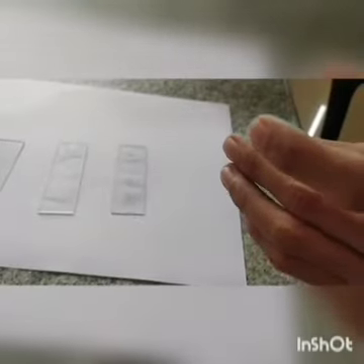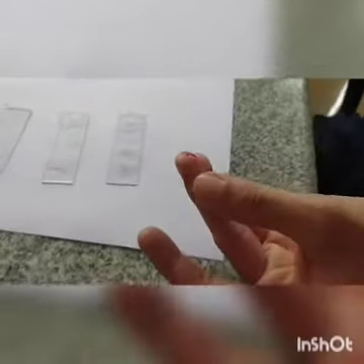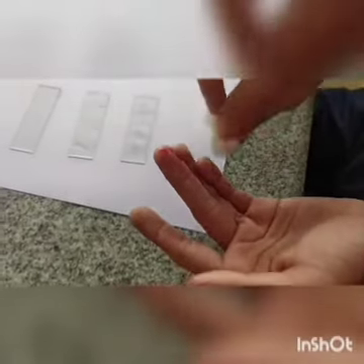Let's start the practical. First we'll sterilize the finger and then pricking. Don't squeeze your finger. Discard the first drop of blood.